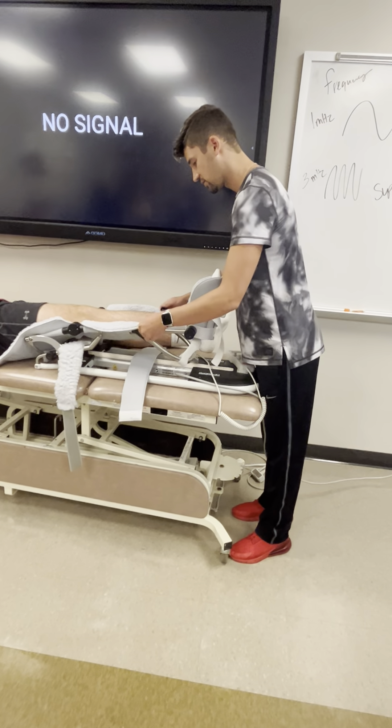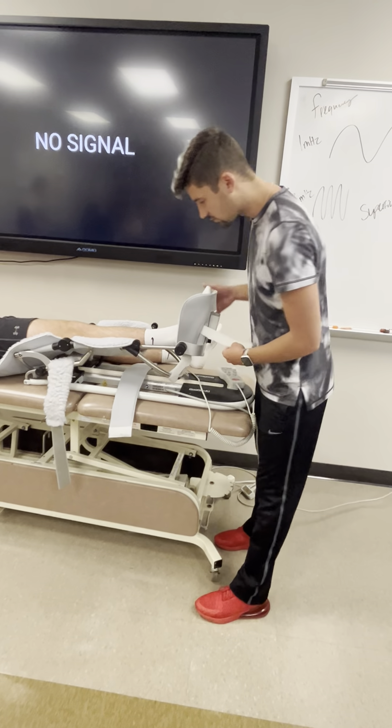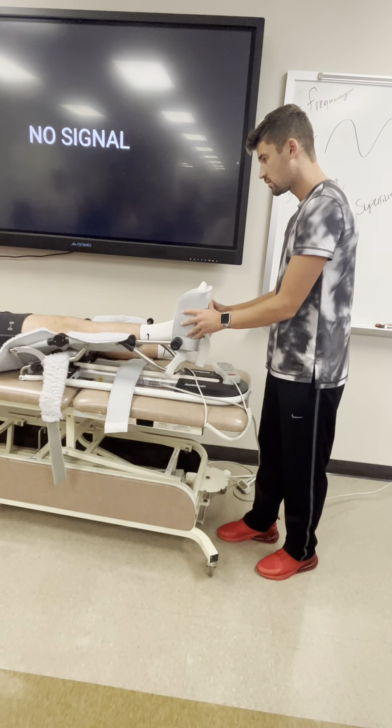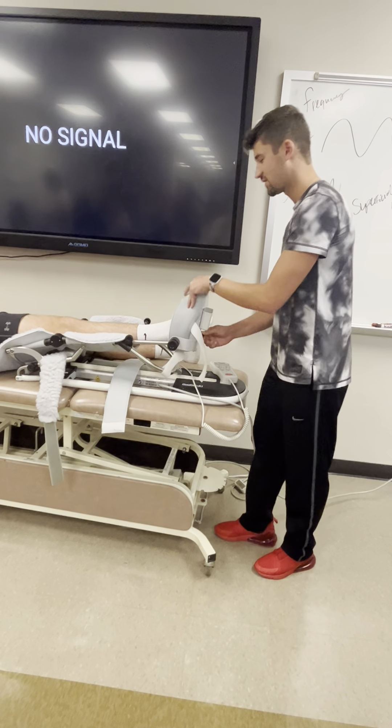Does that feel comfortable? Yes. Is that right there? Feel okay? Yeah, I feel okay.